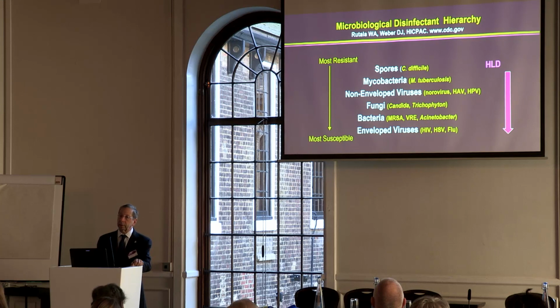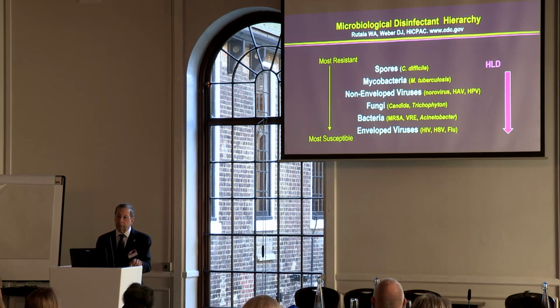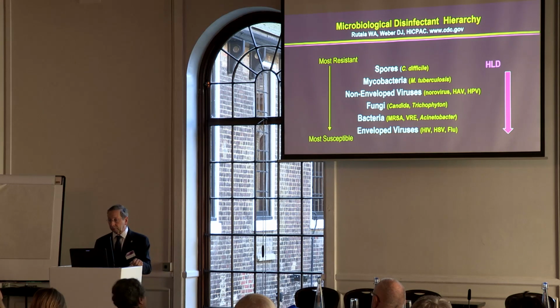When you look at disinfectants, keep in mind here that if we had a spore, high-level disinfection will not necessarily kill high numbers of spores. And the level of sterility assurance for sterilization generally is considered a 12-log kill of the most difficult to kill organism, at the most inaccessible spot of the device, and so that really is meant to be in an absolute sense.